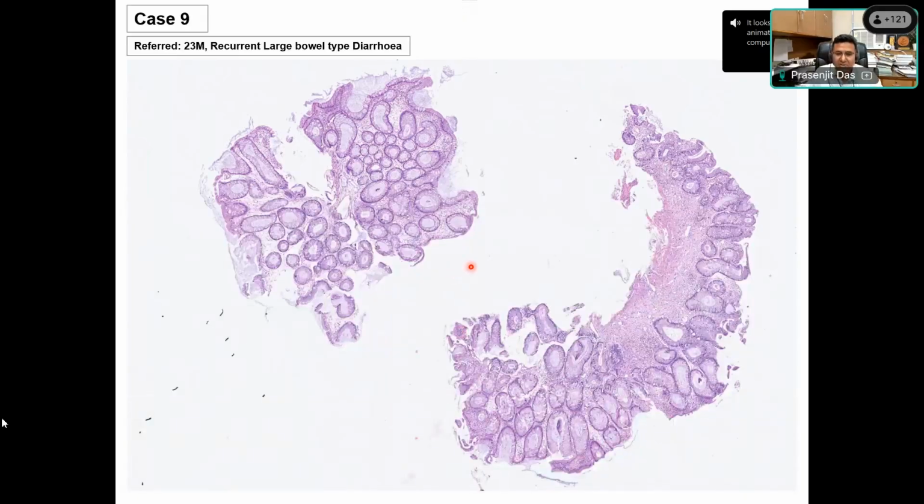So we'll very quickly discuss case 9. Fragments of tissues are there. Colonic mucosa is present, and with preservation of the crypt architecture, these are parallelly arranged and evenly spaced. Do you really think the architecture is preserved? Just try to see. Overcrowding is there, and decrease in the spacing. Overcrowding is also an architectural distortion, isn't it? Overcrowding is also distortion. All these areas are distorted.